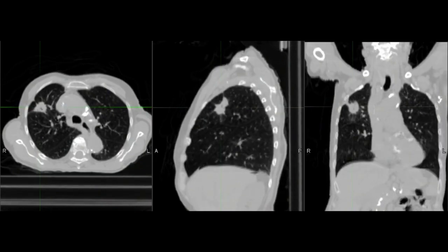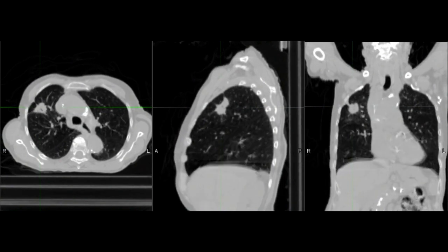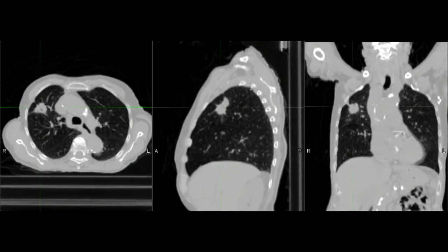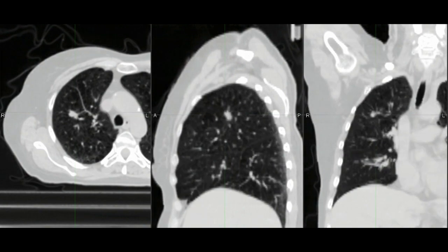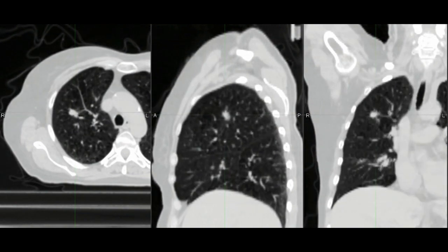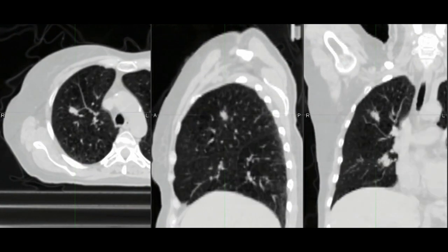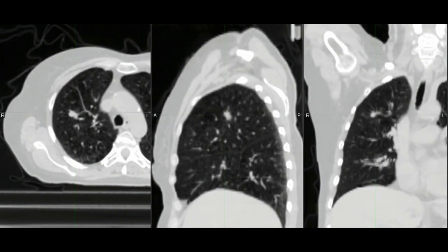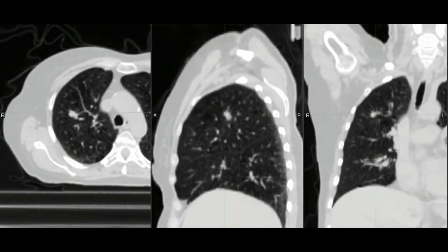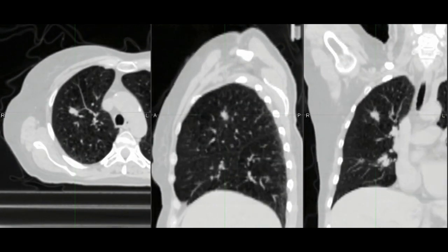Now, the quality of these images improved rapidly over time with multi-slice scanners, and now it's regularly used. Here's a tumor that doesn't move very much, but actually people have studied thousands of these things, and it's not easy to predict, so you really need to do the patient-specific measurement. Here's one where it's moving quite a bit in the AP and the lateral direction, but not very much sup-inf. That's unusual. Most tumors move mostly in the sup-inf direction, and then less in the AP/PA direction, and even less in the right-left direction. But this and other examples like it show that it's important to do patient-specific measurements of this.